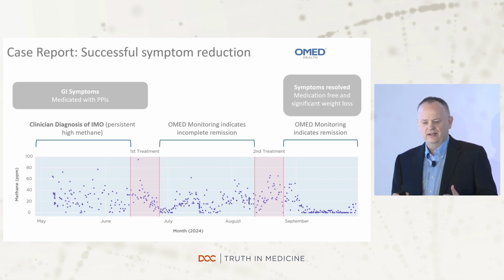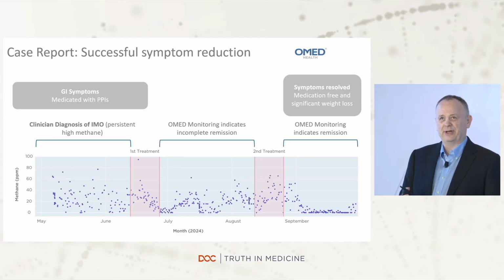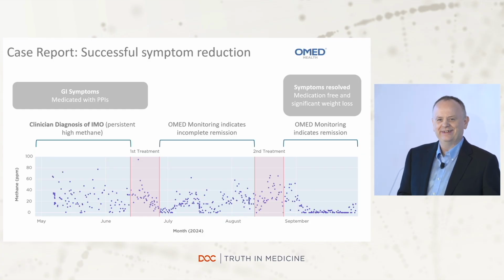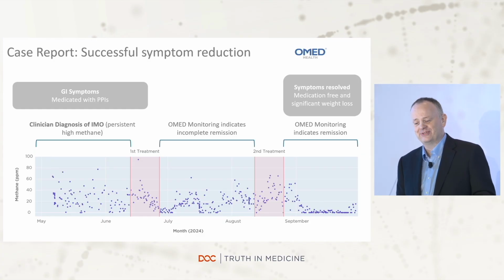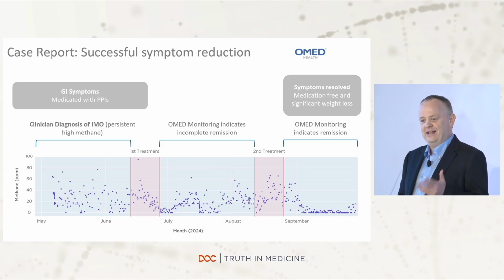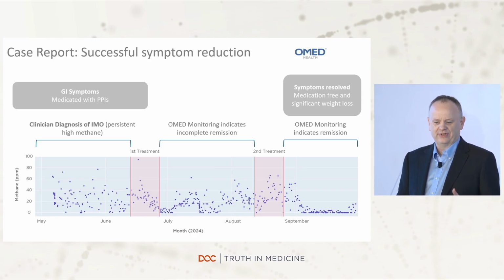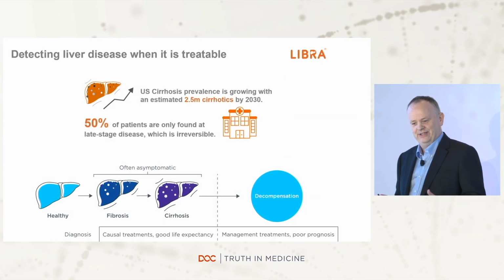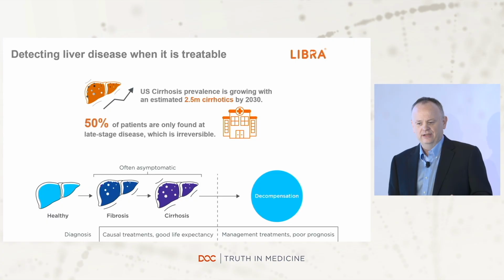And this is where this continuous information, the amount of data you can get from a breath sample, which is available all the time, comes in. I mean, you can always breathe, or you've got other problems. So it lets a patient take many, many samples and really delve deeply into the data that can be generated. But that's not the only application we've been exploring.